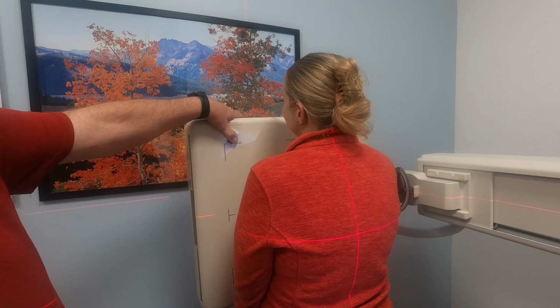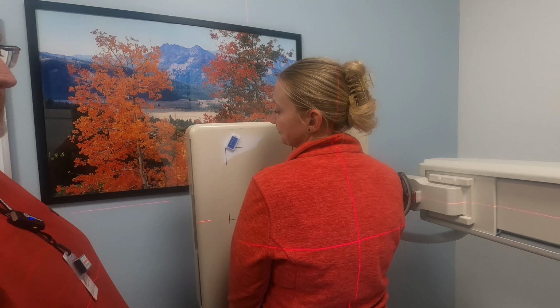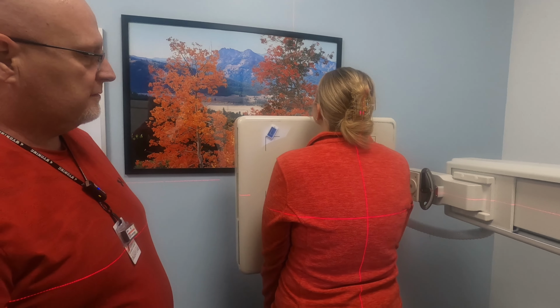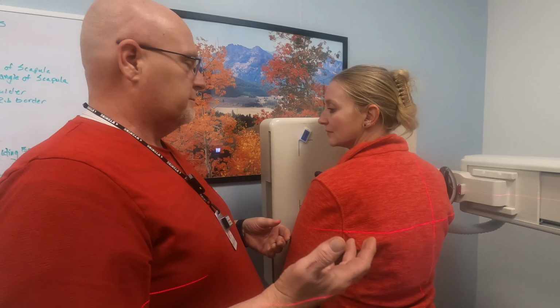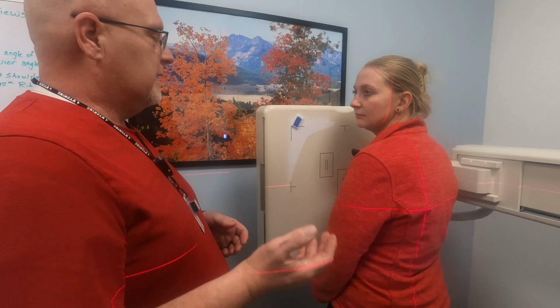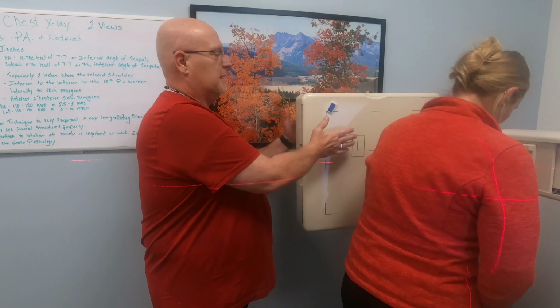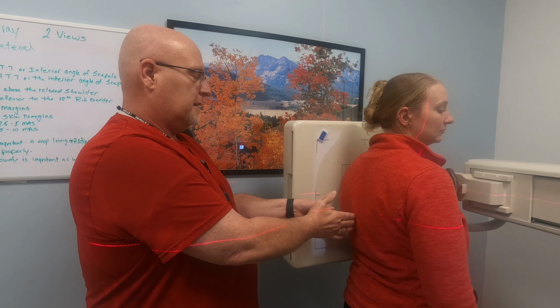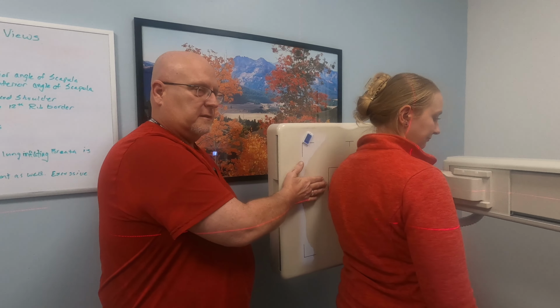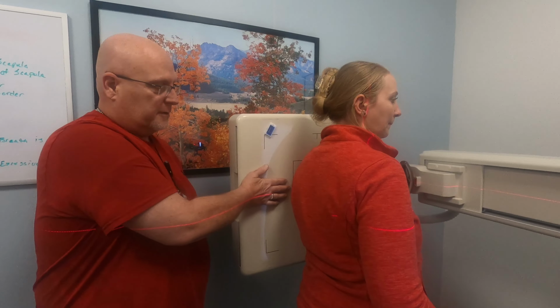Okay, we've got our left marker up here on the left side, so we know that this is the left side, okay? So that is the PA, pretty simple. This time we're gonna do the lateral. So like I said, we're gonna do a left lateral. And the reason we do that is that the heart is on the left side, and we want the heart as close to the image receptor as we can, okay?